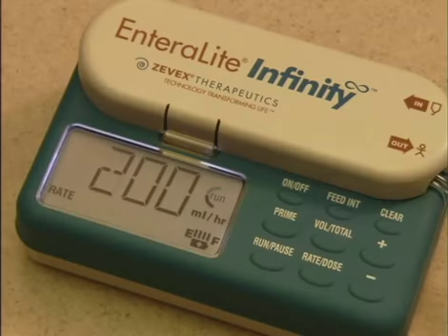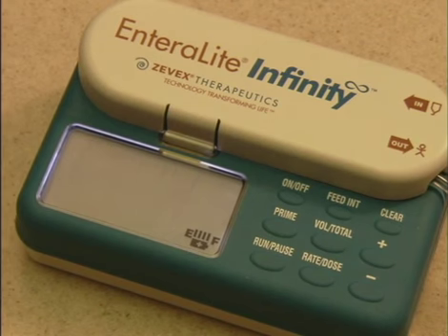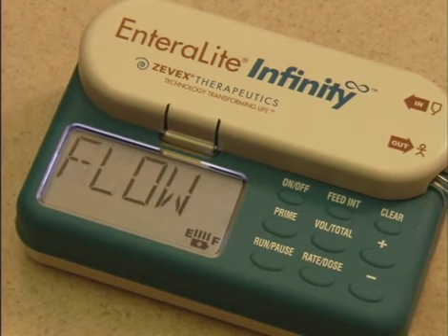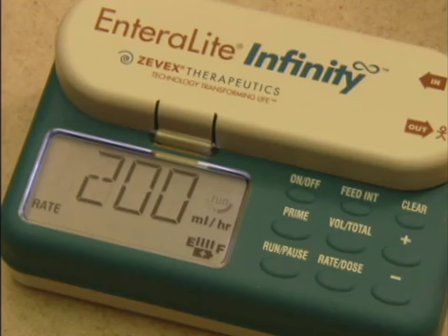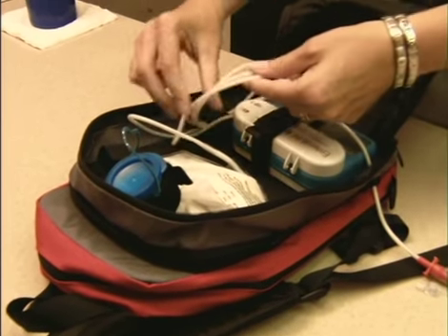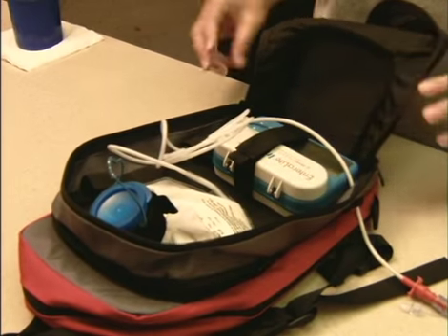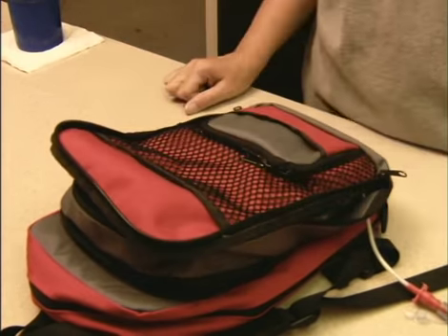If the pump detects a blockage between the bag and the pump, the display will read "No Flow In" and an alarm will sound. The pump may also detect a blockage between the pump and the user. In this case, the display will read "No Flow Out." To correct either of these problems, first press the Run Pause key to silence the alarm. Then check the tubing for kinks or clumps of formula. Also, check the receptacle for cleanliness, especially around the pressure sensors.